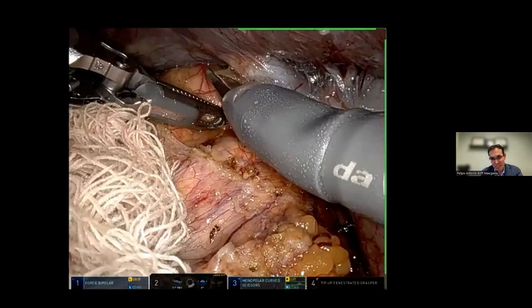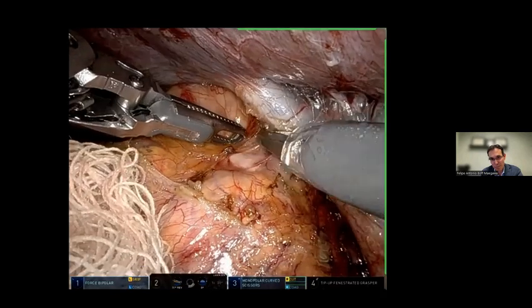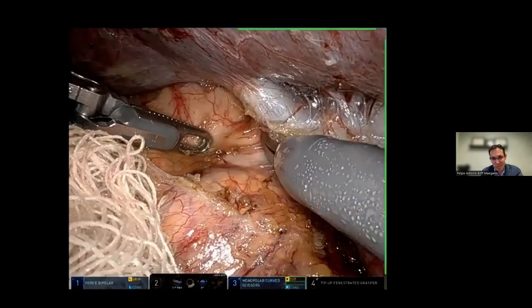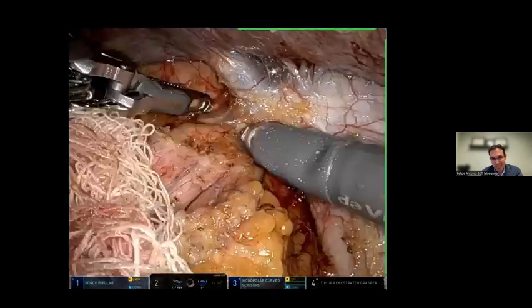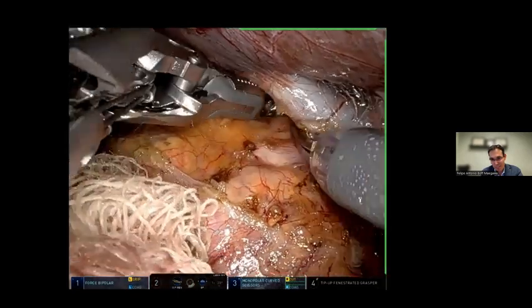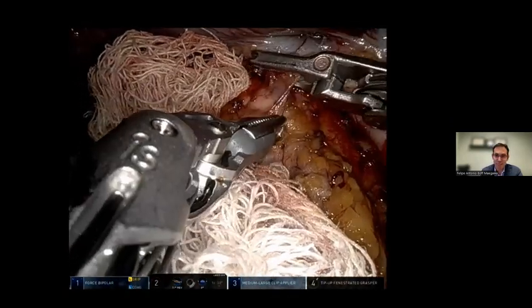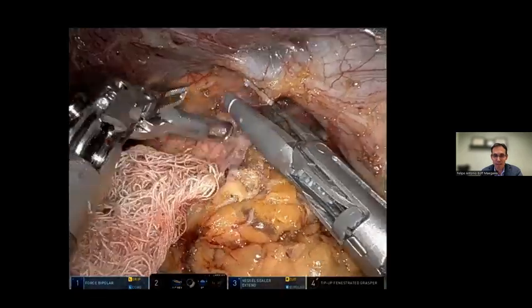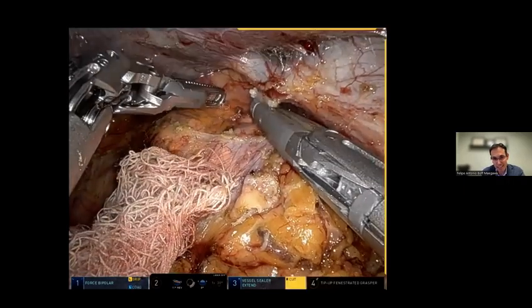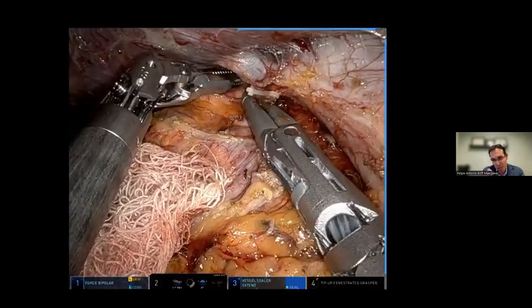It's the same procedure. Try to stay as hemostatic as possible to keep the areolar plane. Once we are around the adrenal vein, then we control in a similar fashion. So we dissect cephalad first, so we go around with the scissors, we see our tip, and that prevents us from poking a hole posteriorly on the IVC, or in this case, the hepatic vein. So hemolock, then go with the vessel sealer. I took a few bites in this case because we didn't have complete mobilization cephalad, and we can do that because we have a hemolock on the hepatic vein.